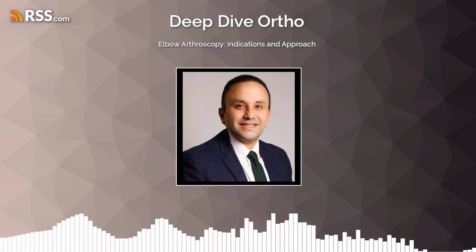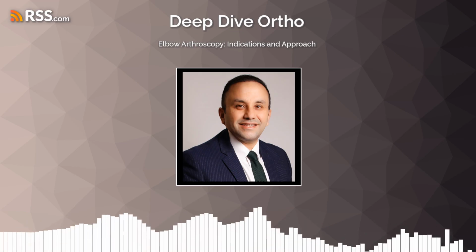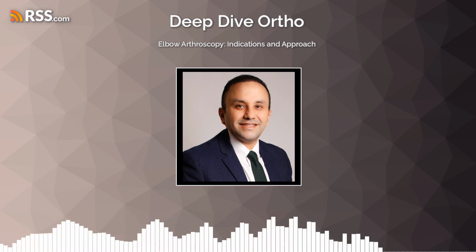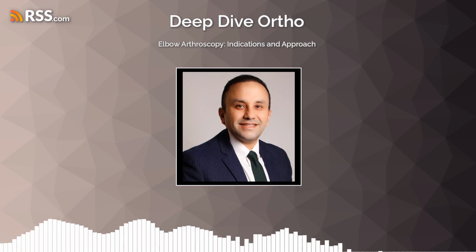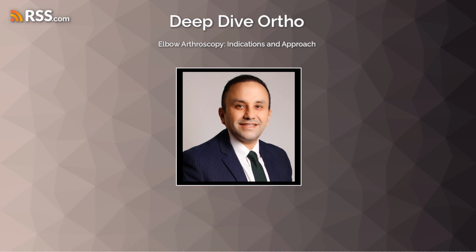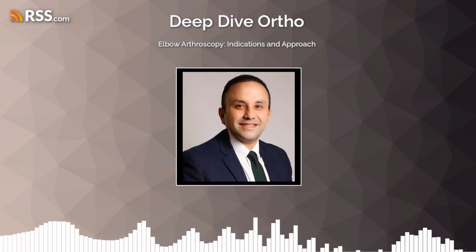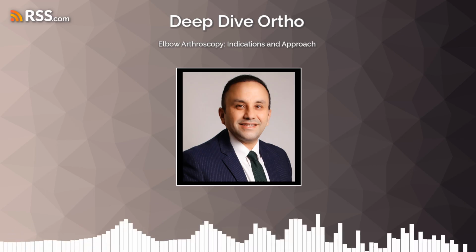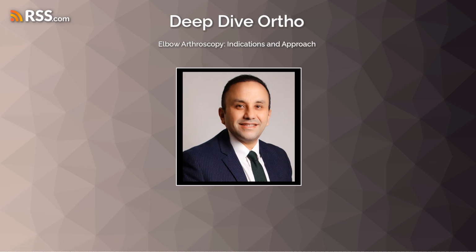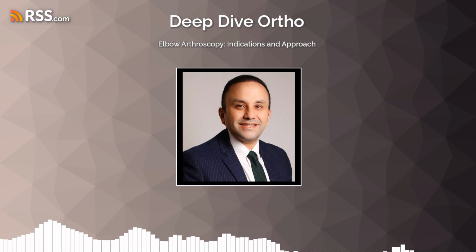The future of elbow endoscopy and arthroscopy is, frankly, incredibly promising, driven by relentless innovation in both technology and surgical technique. While wet endoscopy, similar to traditional arthroscopy with fluid distension, has been the mainstay for over 40 years, dry endoscopy of the upper limb is a relatively new and rapidly developing area that holds significant potential. Dry endoscopy. So working without the constant fluid irrigation. Exactly. Dry endoscopy avoids fluid extravasation, relying on alternative methods of distension.